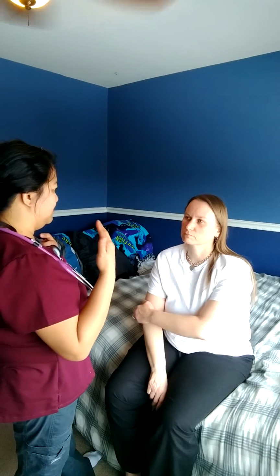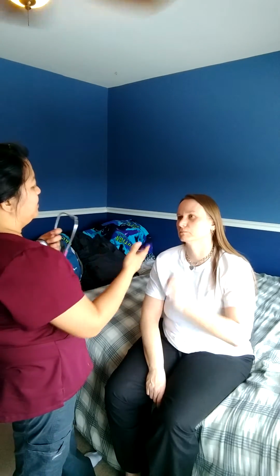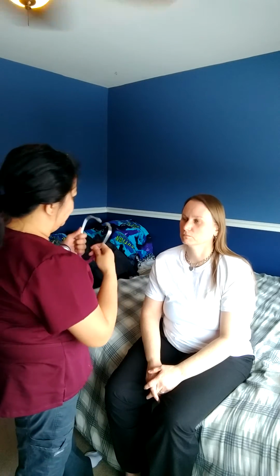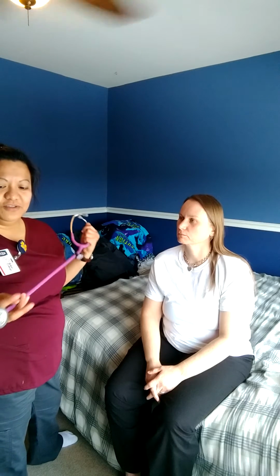So I need you to take a deep breath, and then after you exhale, just hold your breath for a few seconds. I will listen to this side and then do it again, and then I'll listen to the other side. Okay. For listening for bruit, we use the bell side of the stethoscope.